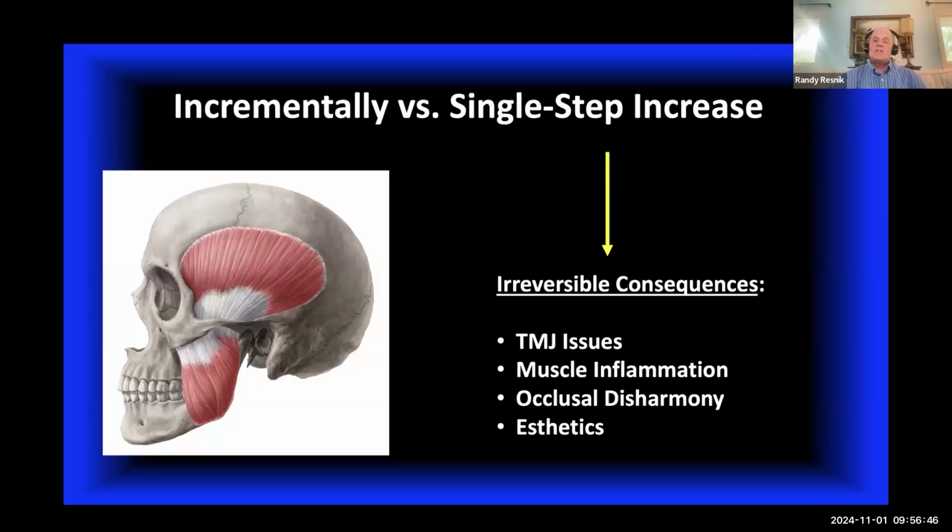We know one thing, patients adapt very fast when you have natural teeth because of proprioception. If they have implants, we know it's very, very slow. So you have to be very, very careful. So my belief is incrementally is a lot safer. It decreases your morbidity. And again, evaluate the risk versus the benefit of it. It's not a big deal to make 2 PMMA prostheses, especially in some of these cases where the patients are really overclosed. Put that in your treatment plan. You can build that in right away, knowing that it is most likely going to happen.